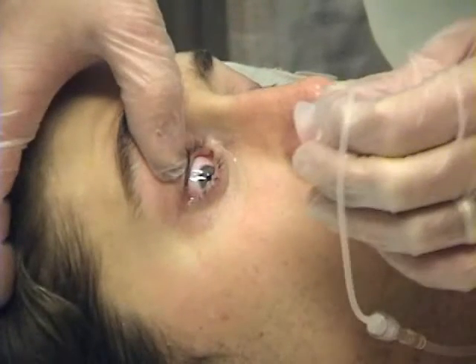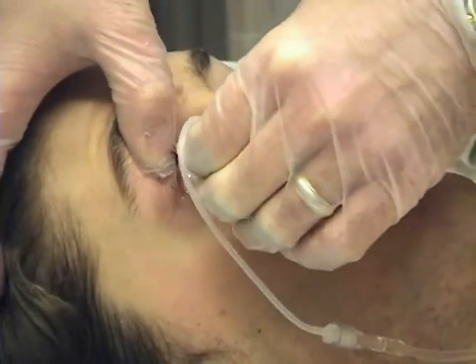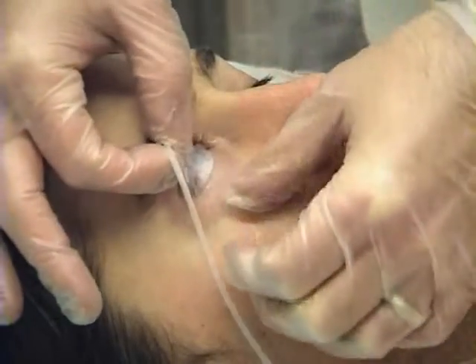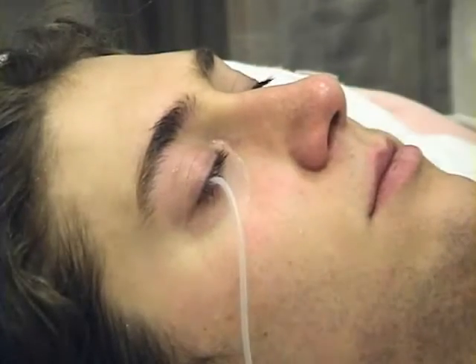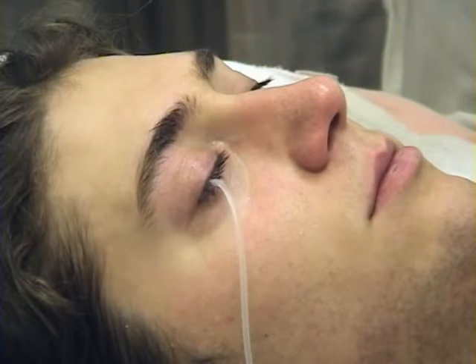Instruct the patient to look downwards and insert the lens under the upper eyelid. Next, ask the patient to look upward and insert the other half of the lens under the lower eyelid. Once the lens is fully inserted, increase the flow of saline through the tubing.